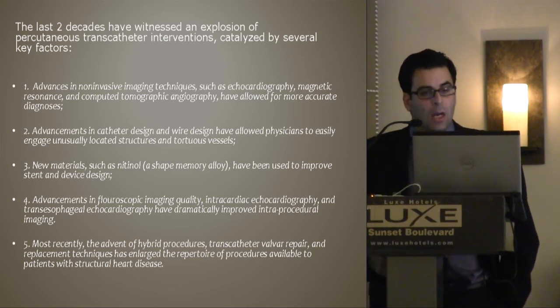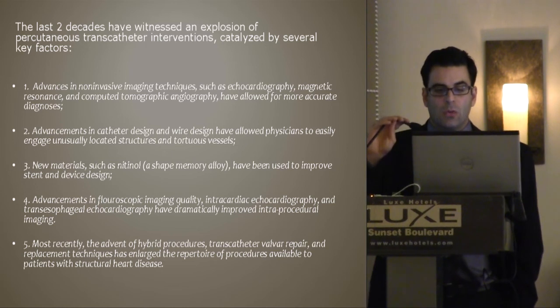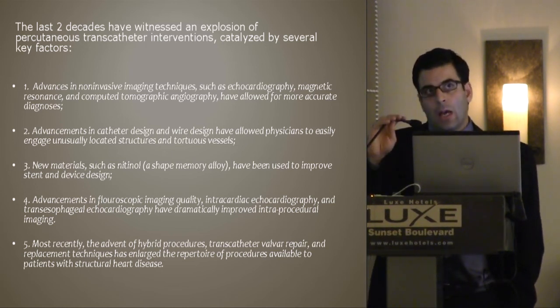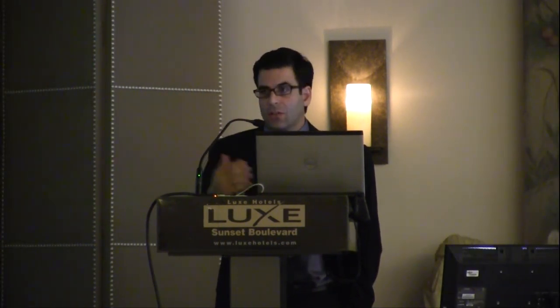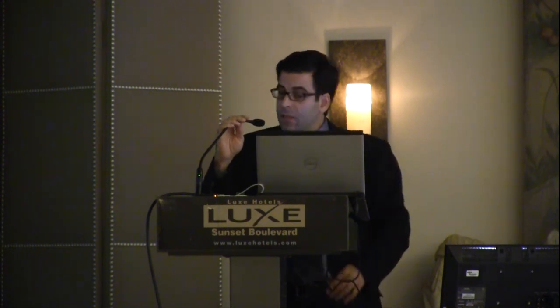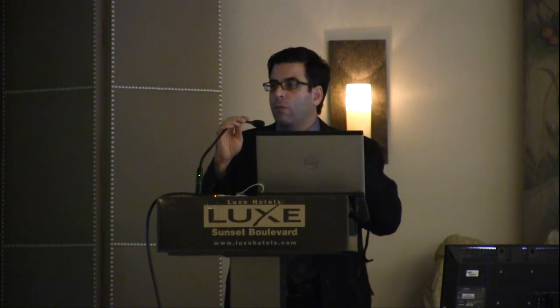We know what we're doing when we go into the cath lab, as opposed to using the catheterization laboratory as a diagnostic laboratory, as it was, and really the way I learned catheterization under Dr. Michael Criley, who I'm happy to say is in the audience, is hemodynamic catheterization. Well, that has unfortunately become a bit of a lost art because of all of these non-invasive imaging techniques. It's still very important to know how to do that, but most of the time when we're going to the cath lab now, we're going for some sort of interventional purpose as opposed to pure diagnostics.